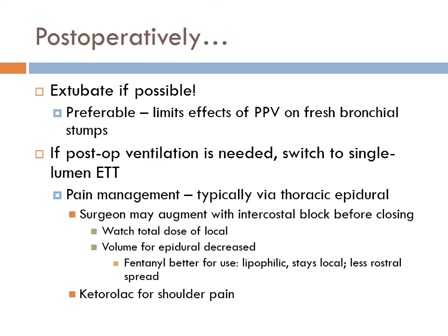So a bougie is normally great when you can't get the tube in. You keep trying to look at it, it's too anterior, you're struggling. It's probably because you're just not good at doing the DL and stuff. But you got like a grade 2.5. Instead of just saying okay, move over, you say, I'm gonna bougie it. Just say it. Know where your bougie is. Bougie's right here. Grab a bougie. Like, I'm gonna bougie it. We're good. Take your tube out.